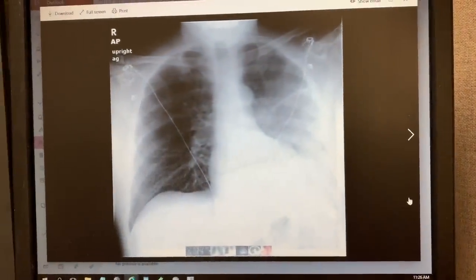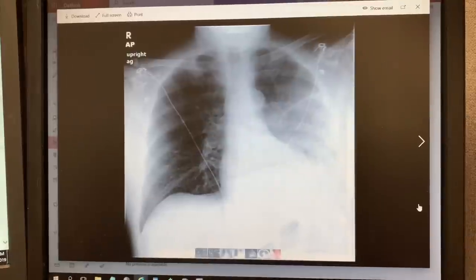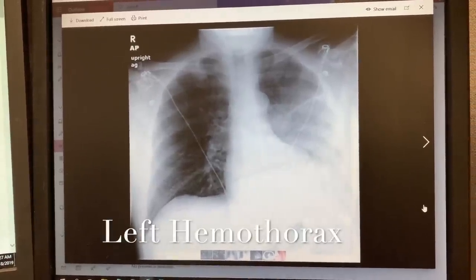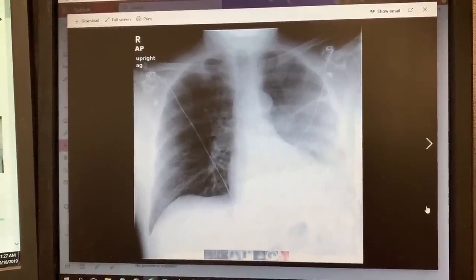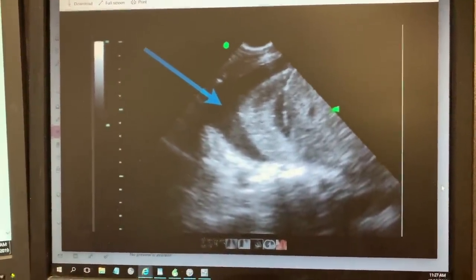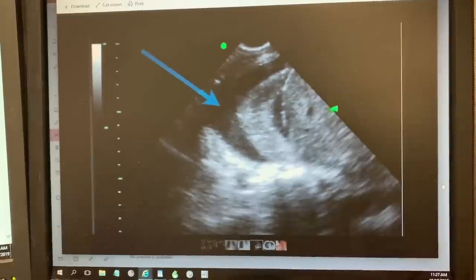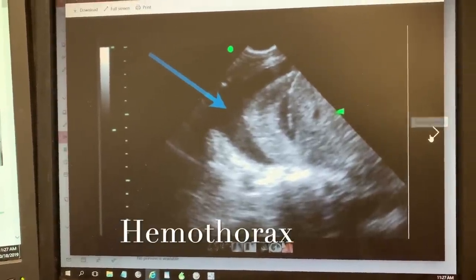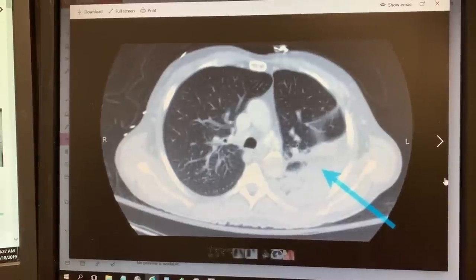Another complication is a hemothorax. Which side do you see it on? What does 'hemo' mean in hemothorax? Blood in the thoracic cavity — exactly. You see all that haziness? That's a hemothorax on the left side. Dark structures on imaging means there's fluid — this is another indication of a hemothorax, again on the left side.